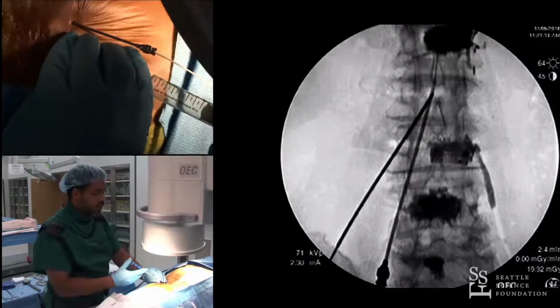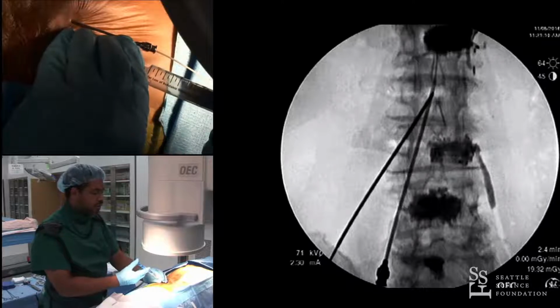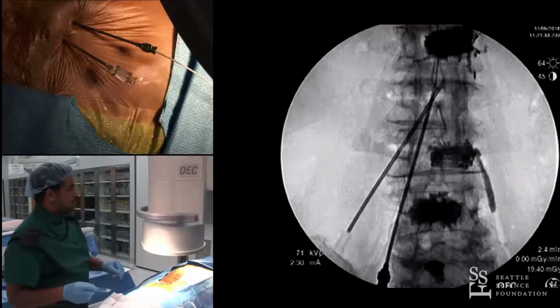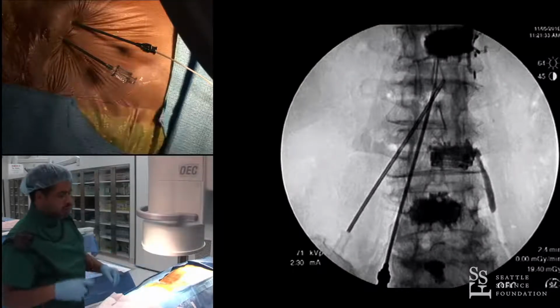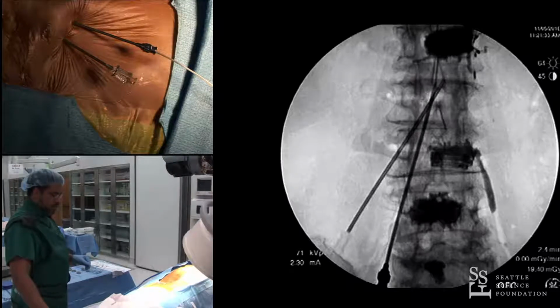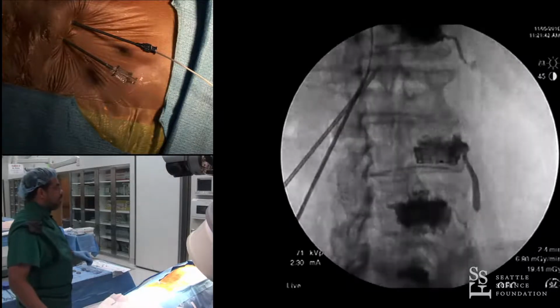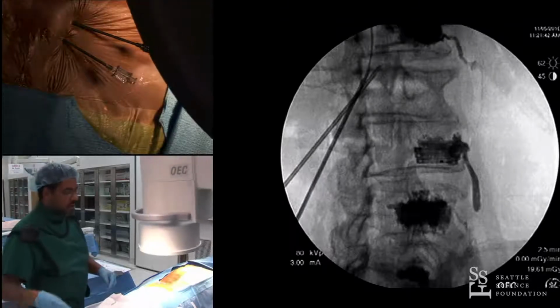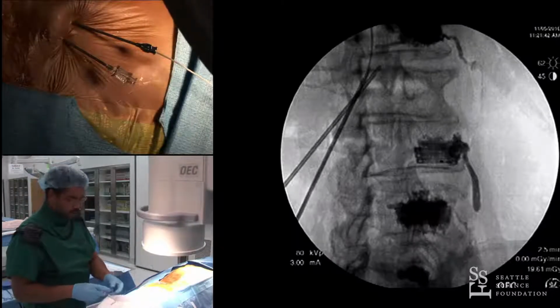So the needle here not really getting the greatest of losses, but let's go ahead and go to contralateral oblique again. All these approaches, I'm not getting the best of loss with this, but let's go back. Felt like a decent loss there.